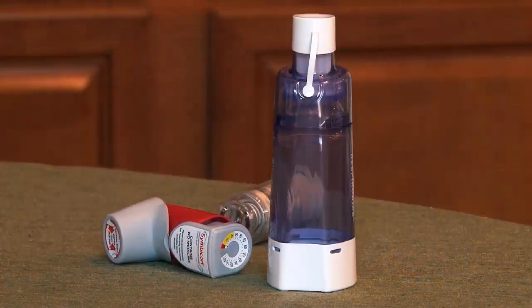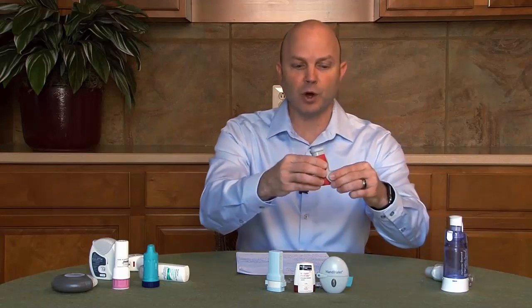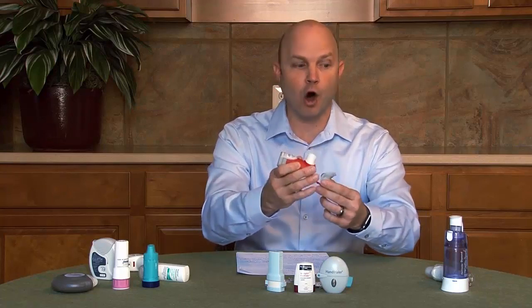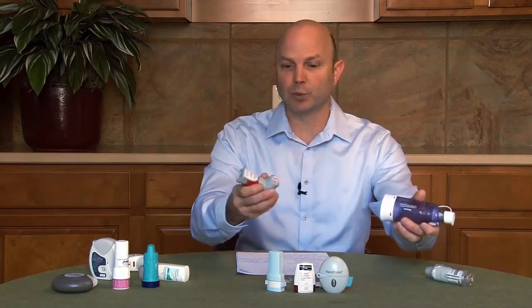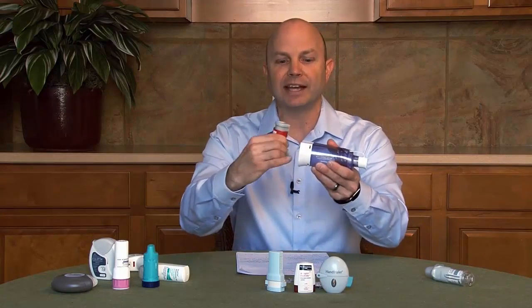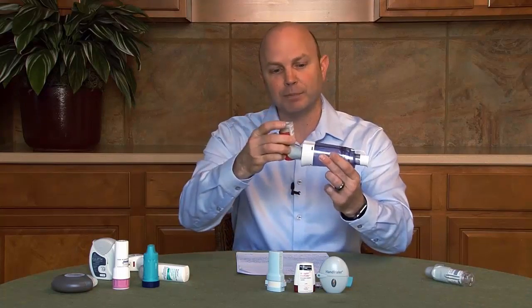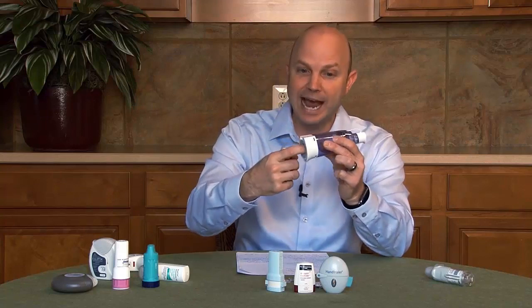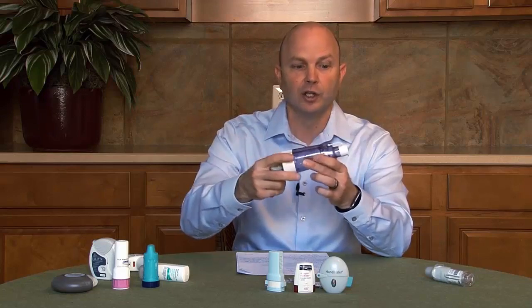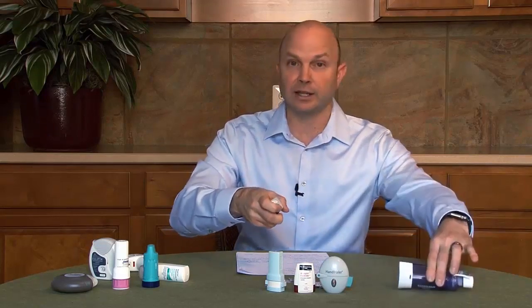This group of medications also needs to be primed the first time you use them. Most of these will also include a cap of some sort, and it's really important to make sure that the cap is off. I've also seen times where people insert an inhaler inside the spacer and the cap gets lodged inside. So each time you go to use this, you're actually putting the inhaler inside, you're recapping it, and you're actually not getting any of the medicine deposited into the lungs. So make sure that you use these properly and the caps are off when you're inhaling the medicine into your lungs.